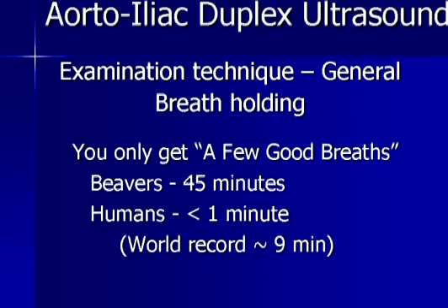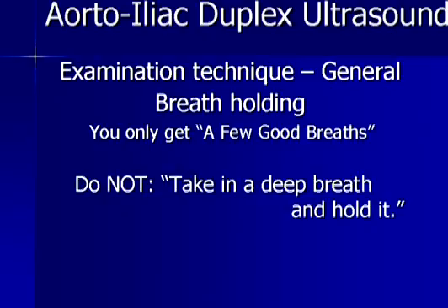We are dealing with humans. Your typical human patient is going to give you, even with a good effort, less than 1 minute of breath holding, and they aren't going to do that very many times. Typically, you can expect a patient to hold their breath for 10 or 15 seconds for a number of times during the course of the study, but not much longer than that. Anecdotally, just for your information, the world record for a human breath hold is just under 9 minutes, so keep that in mind too.